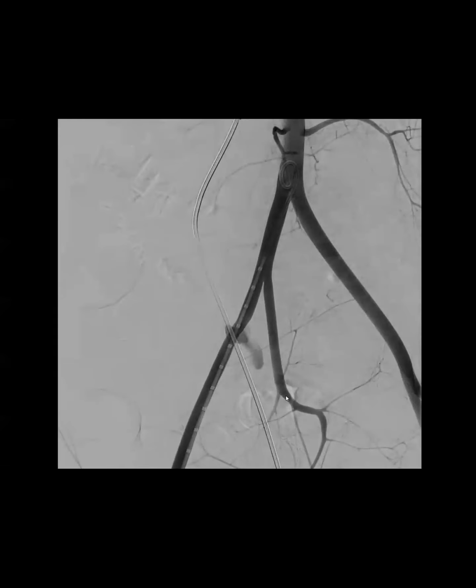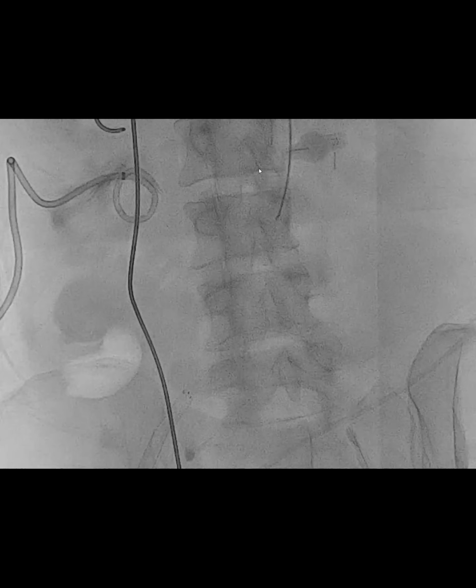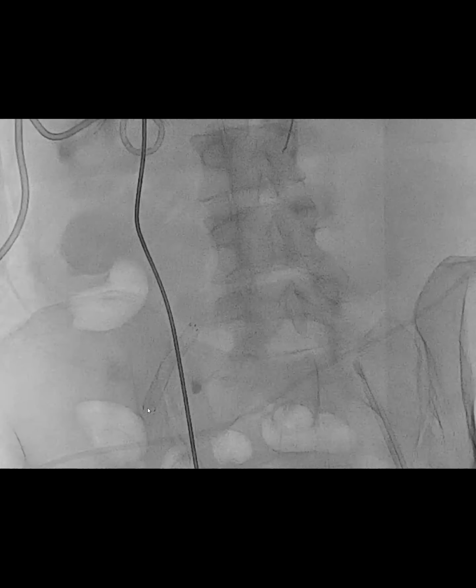Here you can see they shot the angiogram and it is extravasating into the ureter, basically where the ureter is obstructed. The treatment for this, if you see it, is a stent. They placed a stent over the artery, and that's how they prevent the extravasation into the ureter. So that's what I want to show you. And then I want to show you this interesting paper I found.